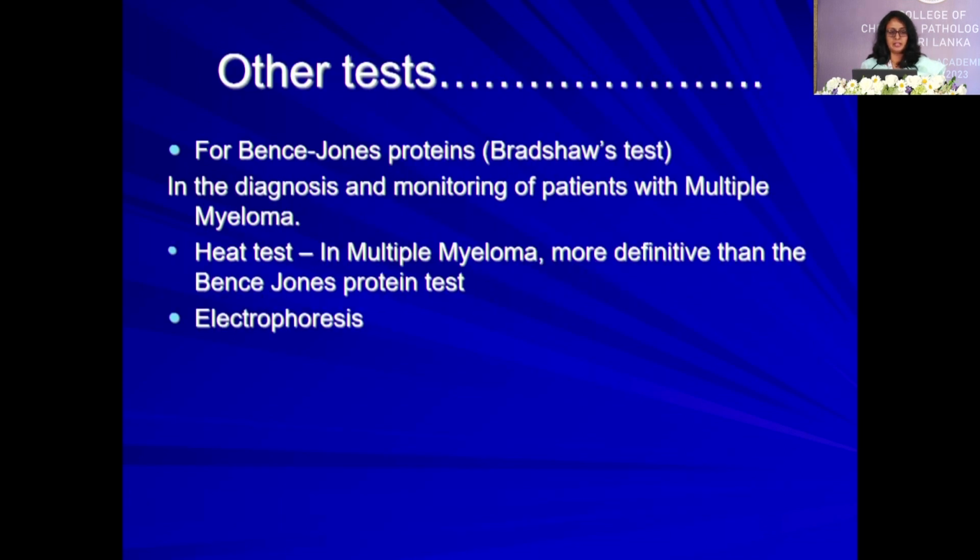And the other test they ask for is for multiple myeloma. For Bence-Jones protein, we can do the Bradshaw test, but in multiple myeloma, the heat test is more definitive than the Bradshaw test for Bence-Jones protein. And also we can do urine electrophoresis.